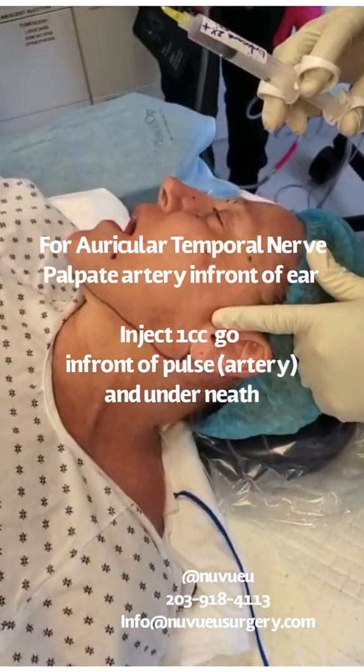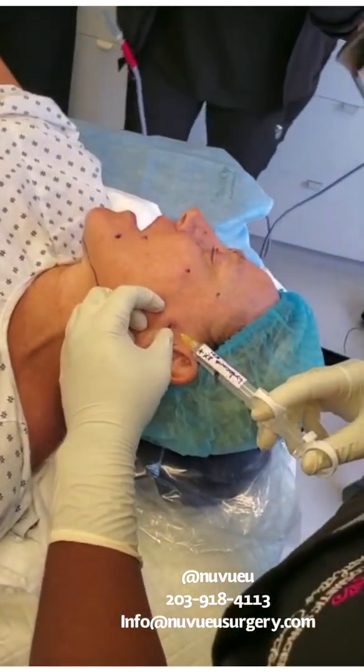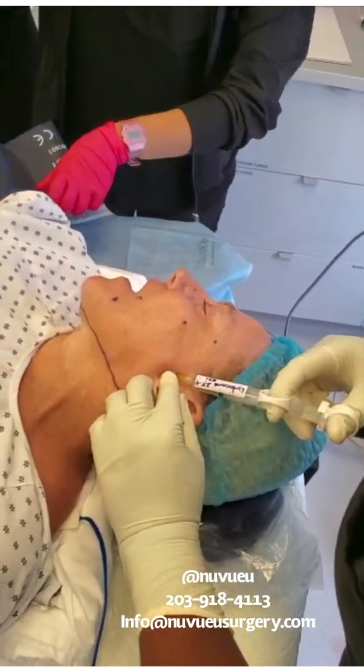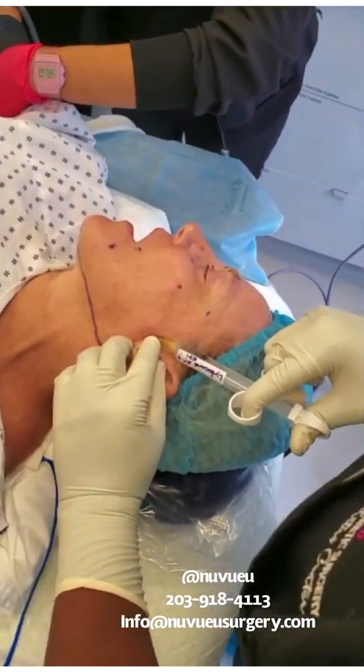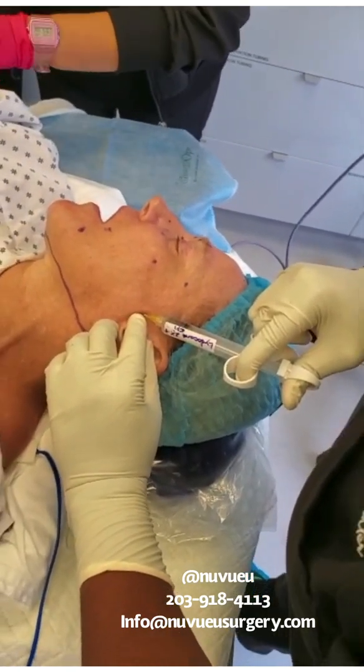You feel for the artery — you'll feel like a pulse. You want to go underneath the artery. Always aspirate to make sure you're not in a vessel, and you're going to inject one cc. And that blocks the auriculotemporal nerve.